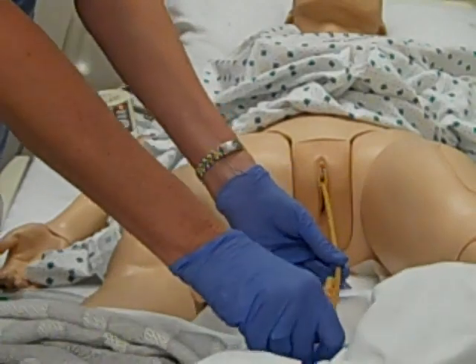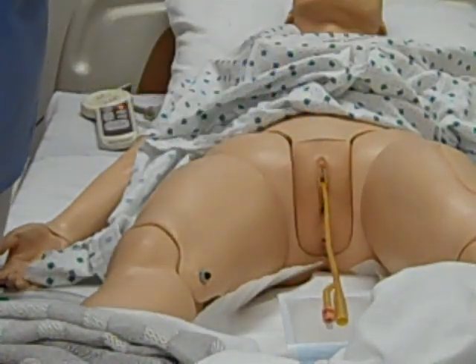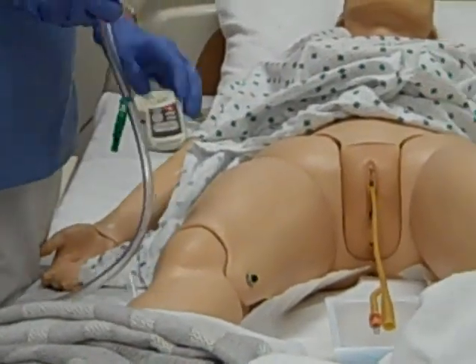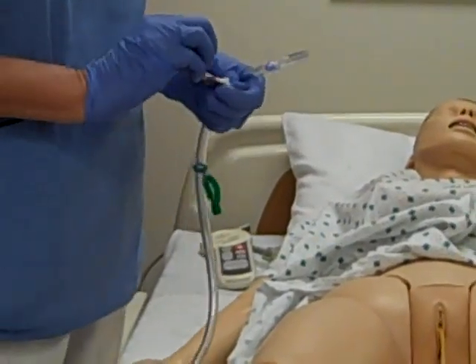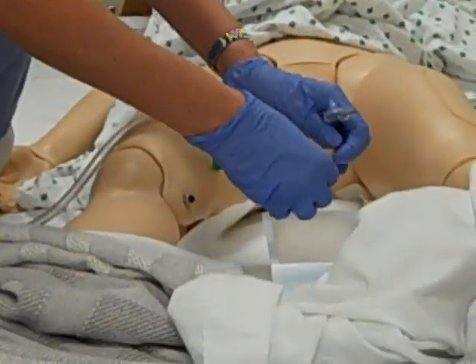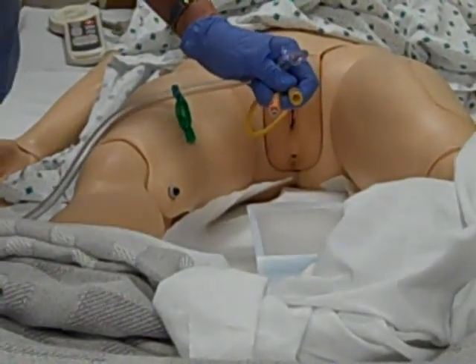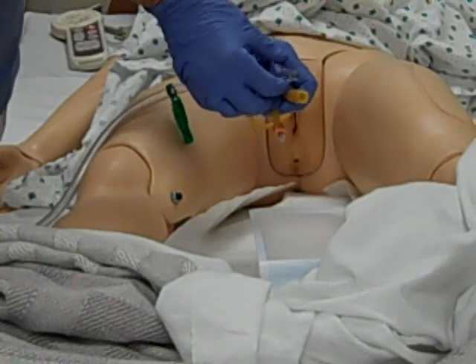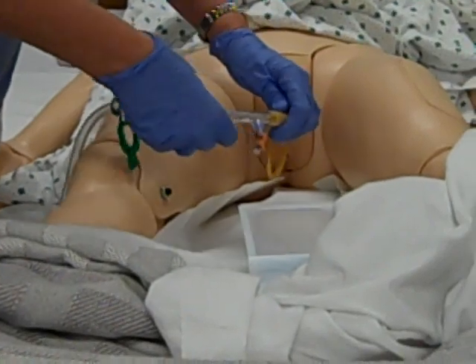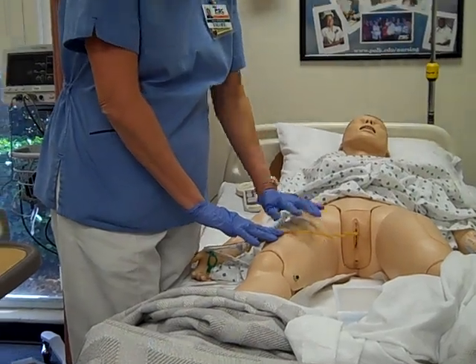We can see a clot come back, and now it looks like it's draining without any problem, so we can hook it back up. Take your cap off. We do want to use that extra alcohol swab and wipe this off again before we reconnect, just to make sure there was no contamination. Of course, if we needed to, we could instill another 30 to 50 cc's if we still didn't have a return — but you don't want to do that too many times if you're not getting anything back. Go ahead and reconnect, loop your tubing, and we would re-tape this back on the patient's leg.